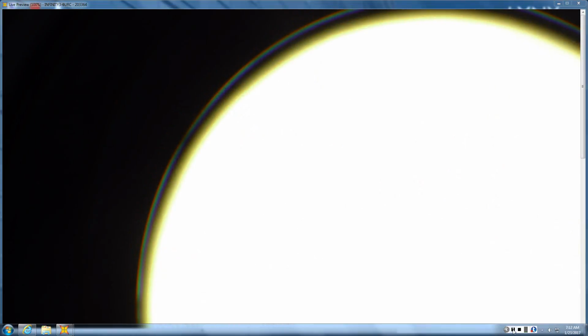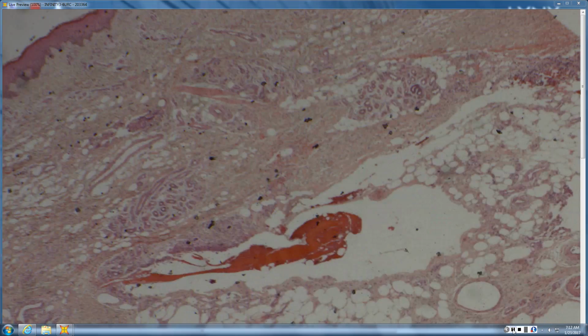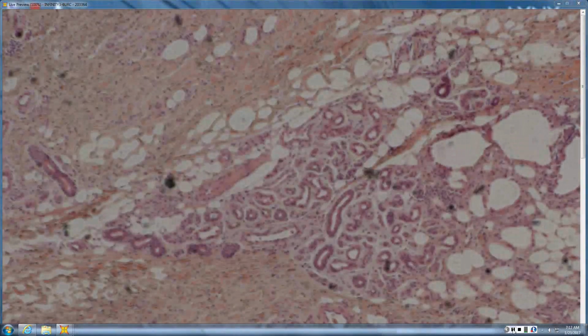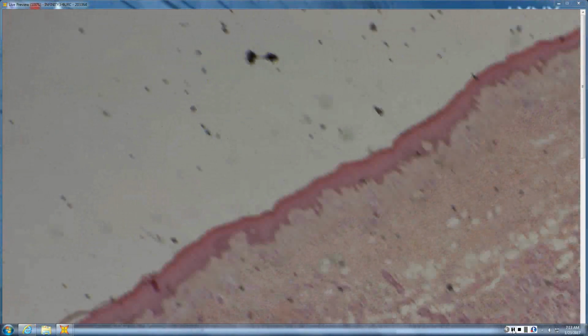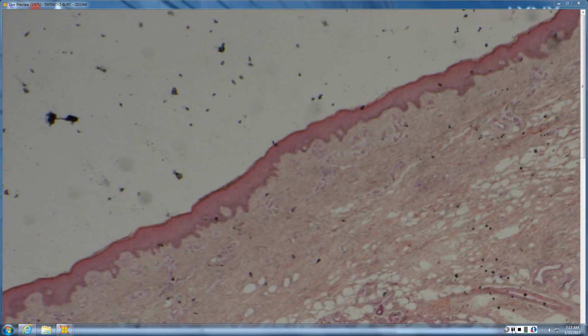So, the last one. So, I'll go back to scan. So at scan, you do have some helpful clues. So, one is location. This slide is really dirty.